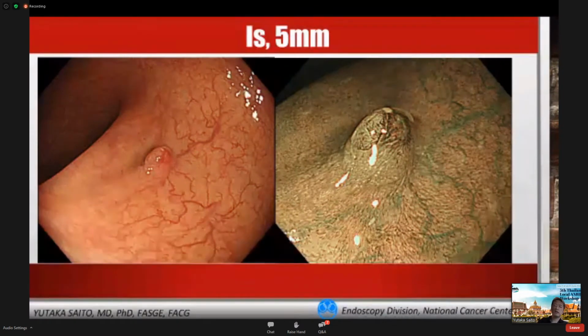How about this lesion? A small one. This is a case at our National Cancer Center. A red polyp, and if you look carefully, some stretching of the fold. Could you observe? And in the NBI, there are differences. The top of this small tiny polyp has some vessel pattern, brownish, and the right side and left side are different. And the lower part could be the normal mucosa. So this could be some SMT-like elevation with some fold stretching, if you look carefully.